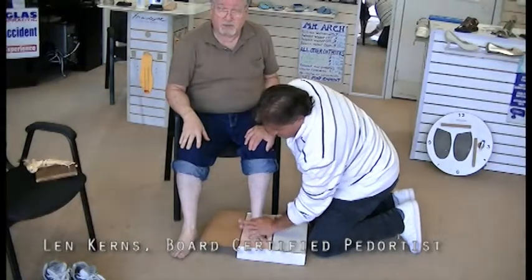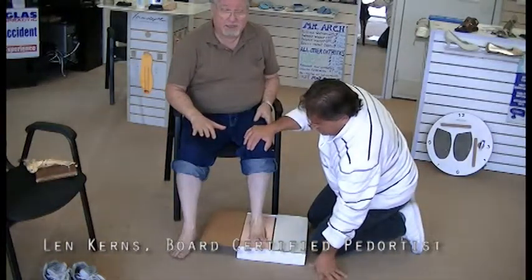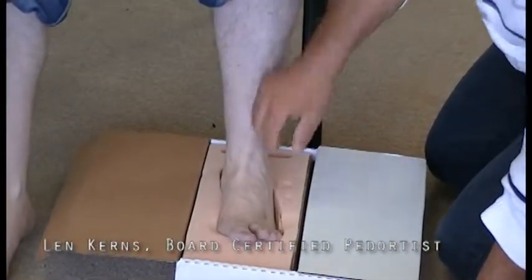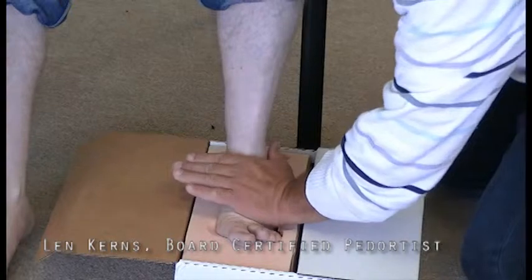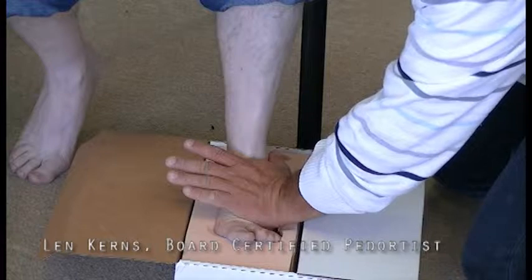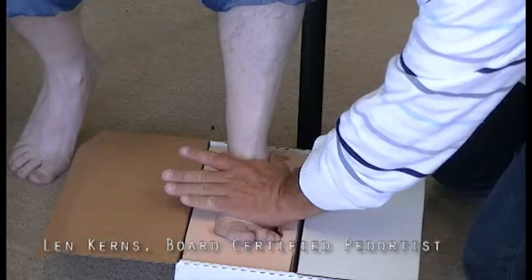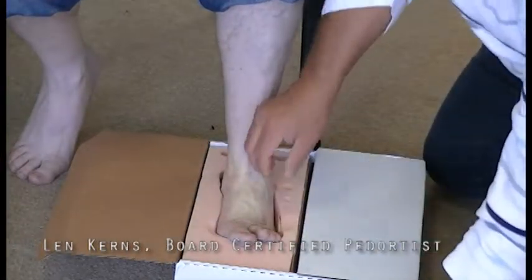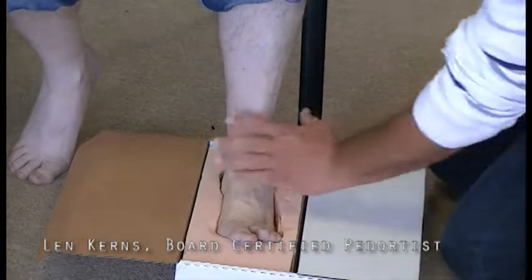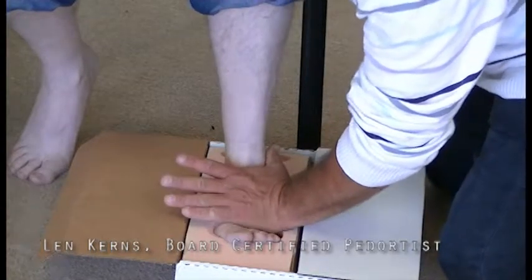And it's very simple. At this point, you notice the forefoot has still maintained its varus deformity, as you can see in the box. Now Mark's going to place the palm of his hand across the metatarsals. Now, if your hand is smaller than Mr. Bigfoot, you must incorporate the fifth with your hand, because as he's pushing the heads down, the fifth is going to go down, down, down until the fifth hits the bottom of the box. And do not roll your hand across the heads, or you're going to destroy the varus deformity.